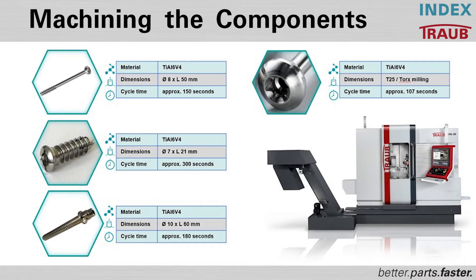Screws are used in different areas of the body. The first is for the foot area, the second for the head, and the third for the spine area. On the right side, you can also see the special possibility of producing torques.